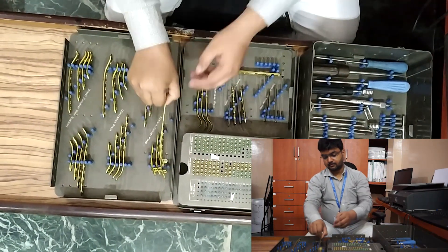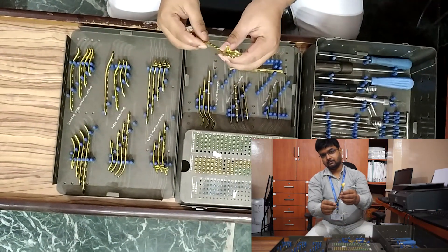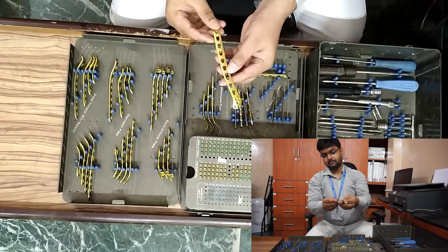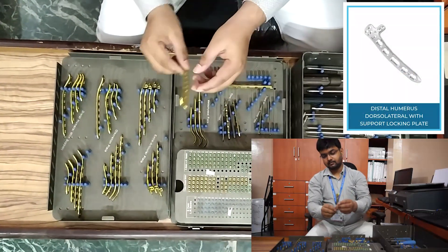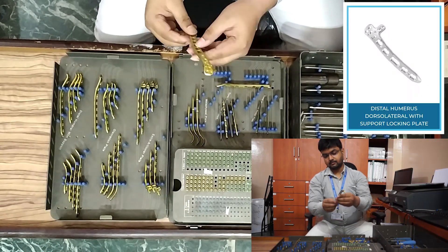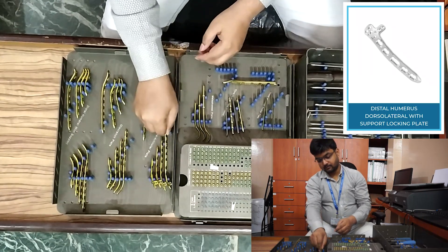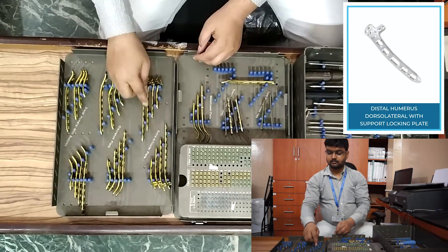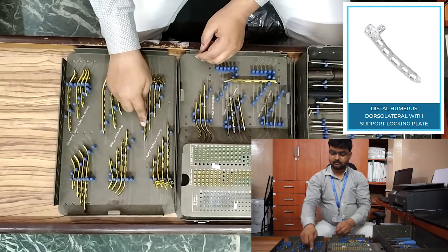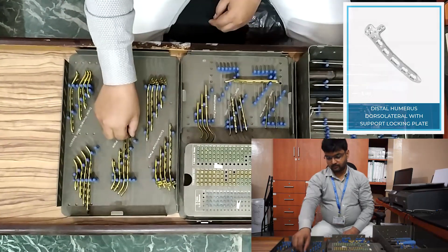Now we are going to start with distal humerus locking plates. First, the distal humerus locking plate dorsolateral with support. This is a side-specific plate — it comes in left side and right side, and is available in three-hole, five-hole, seven-hole, and nine-hole configurations. Longer plates are also available.